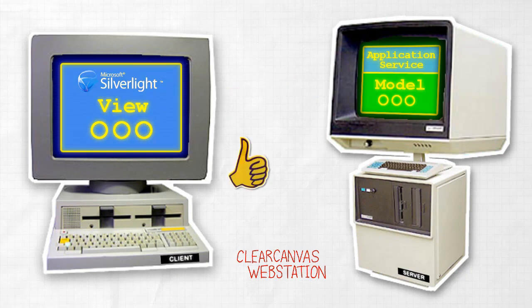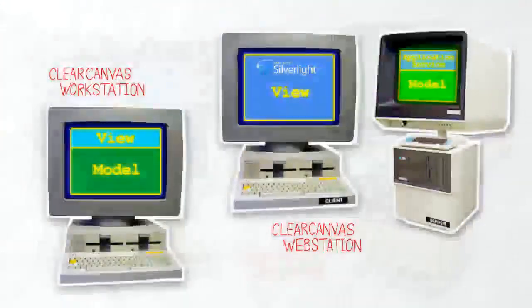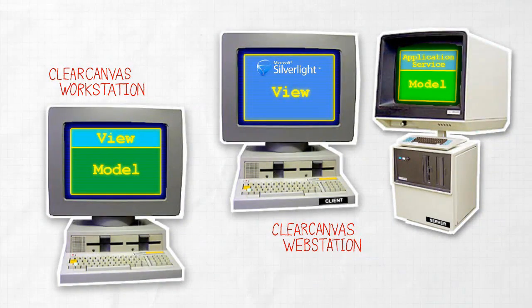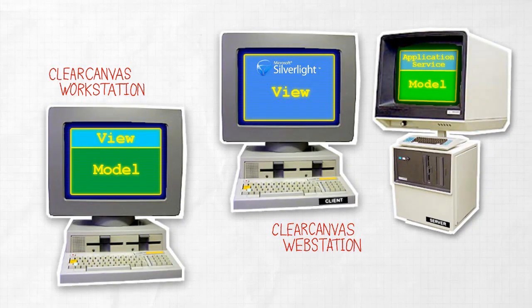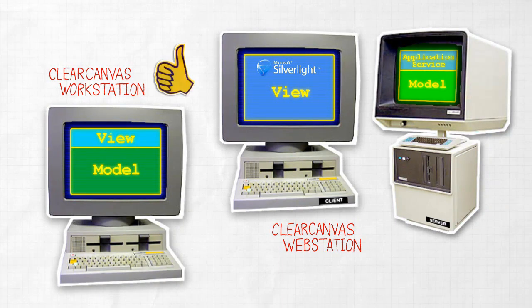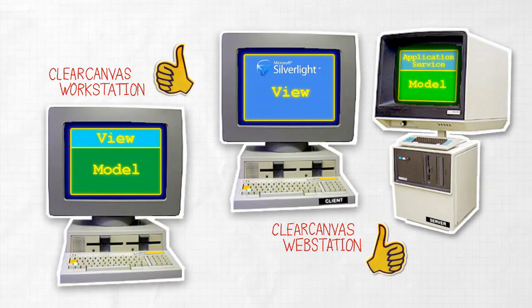If you've ever added new functionality to the ClearCanvas workstation, you'll know that it's as easy as dropping a model plugin into a directory. For the webstation, all we've done is move the model plugins to the server, which means that new features implemented for the ClearCanvas workstation can easily be made available in the ClearCanvas webstation, and vice versa. That's how easy it is to implement feature-rich, web-based image viewing using the ClearCanvas webstation.